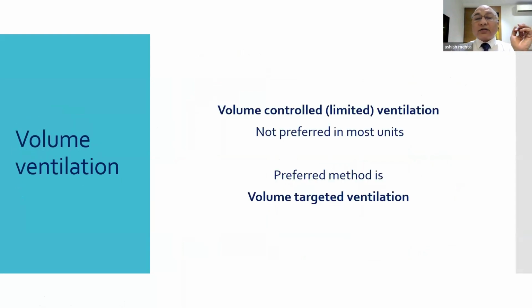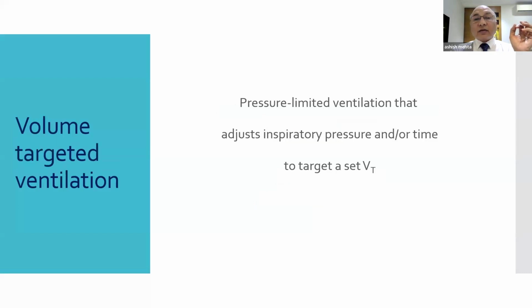Volume control ventilation is not preferred in most units. The preferred method is volume targeted ventilation. What is volume targeted ventilation?